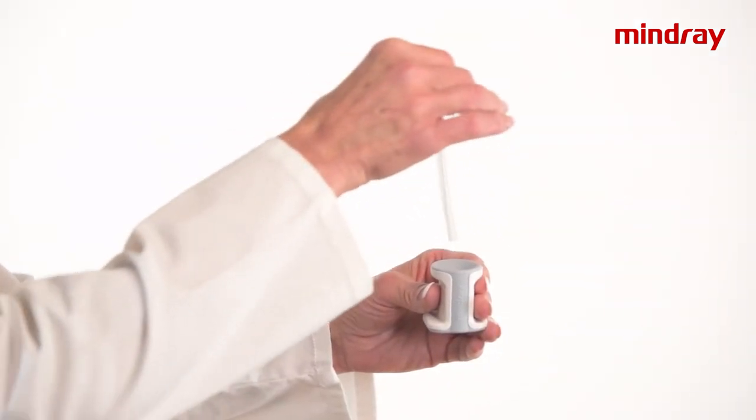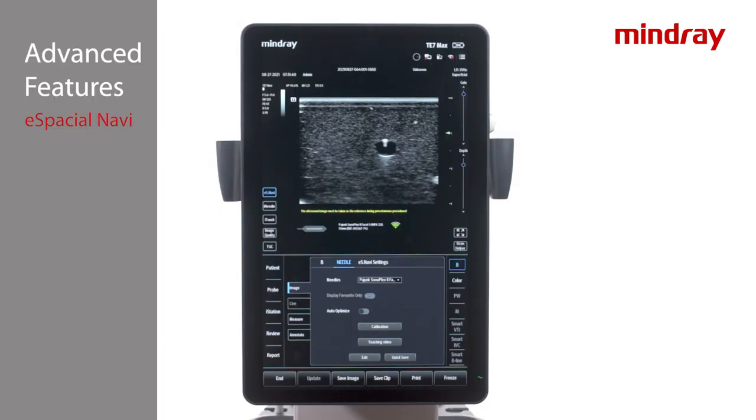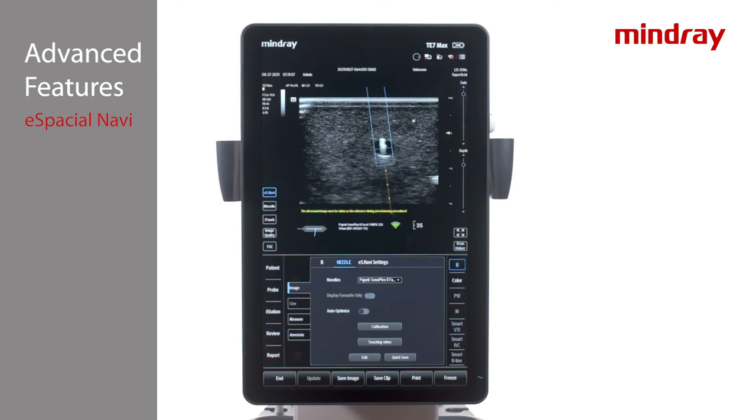Make sure the transducer indicator notch is toward the left of the screen during calibration — the notch correlates to the M on the imaging screen. A message will appear when complete. Magnetize the needle by placing it in the magnetizer with the cap on all the way to the bottom for a second and pull back out. Notice the trajectory or dotted line on the screen before touching the patient with the needle. Blue indicates the needle is crossing the ultrasound beam and light blue is close to the beam.